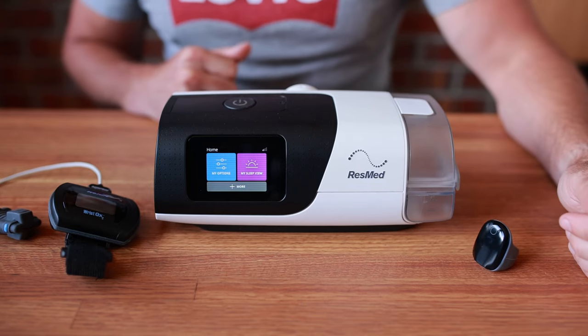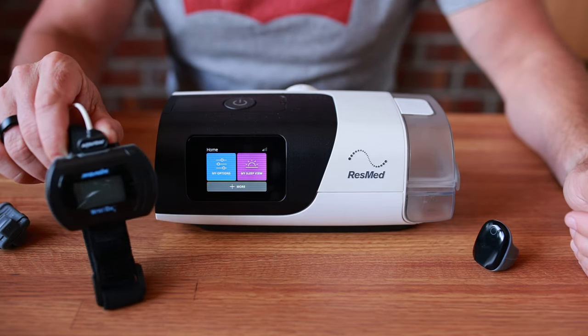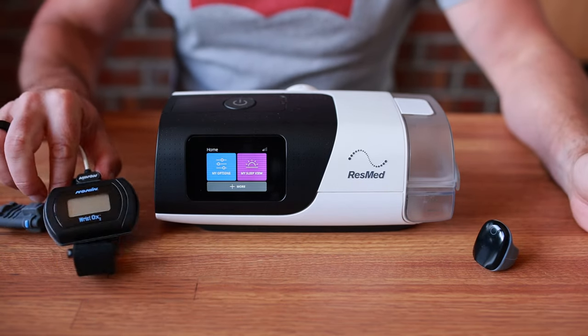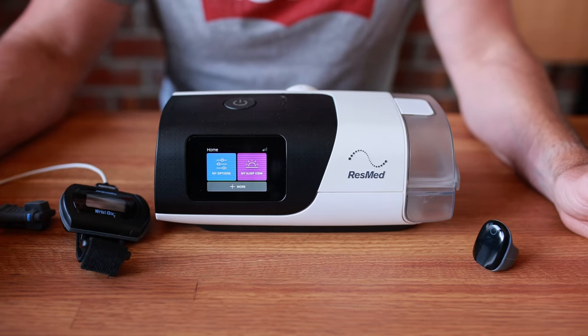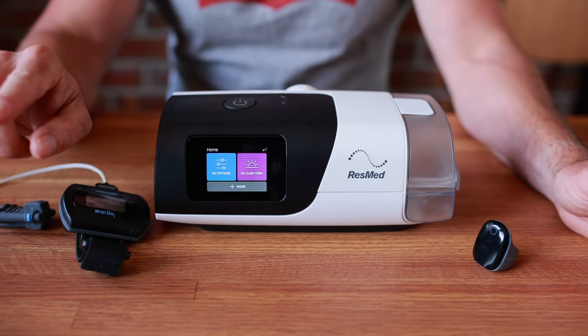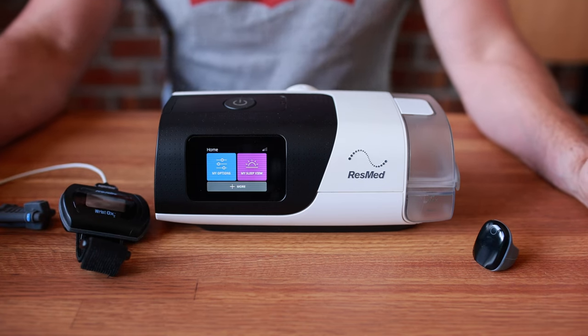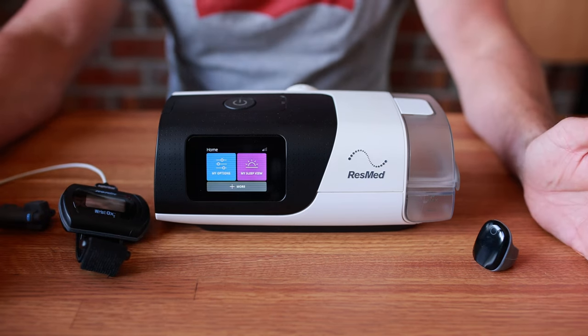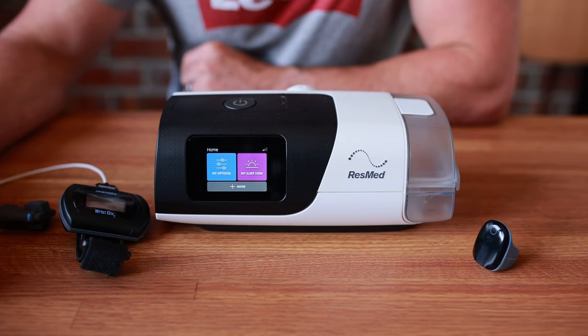G'day mates, uncle Nico here. He's cracked the code and today I'll show you how to connect up a Bluetooth oximeter with your ResMed AirSense 11. They released this feature a few months ago with an over-the-air update, and it's been driving me nuts because I had this new setting 'connect Bluetooth oximeter' and had no idea how to use it or what gear I needed, because ResMed provided absolutely no information after updating the devices.